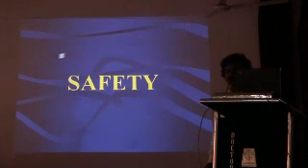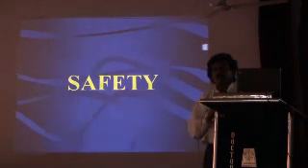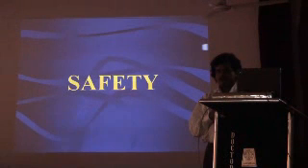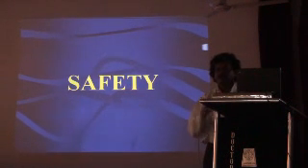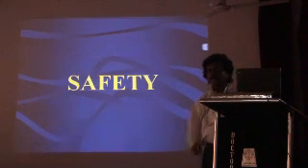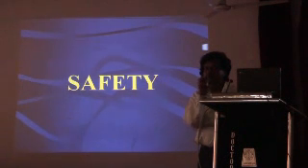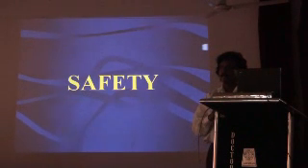Now as far as safety is concerned, how much safer is MR? MR we call it God's gift, because it is one of the safest investigations, but it has certain hazards. What are the absolute contraindications of MR? Metallic implants, pacemakers, clips. Dentures, metallic implanted clips.